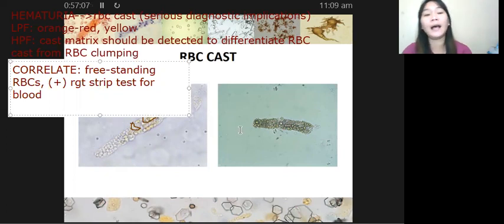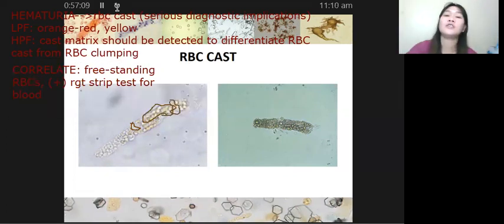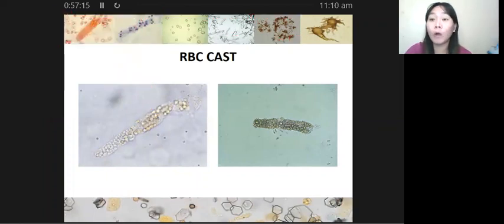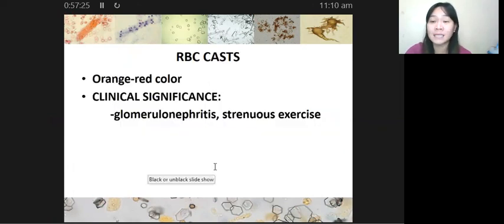Okay, nakuha. Ayan. Alright. So, yan po, hematuria, kung talagang hematuria siya. Pero, again, class, pag hemoglobinuria, myoglobinuria, so remember, your hemoglobin and your myoglobin are toxic to your renal tubules. And so, ang kasama ni RBC cast ay si RTE cell.